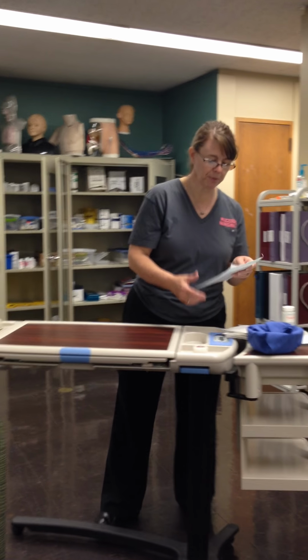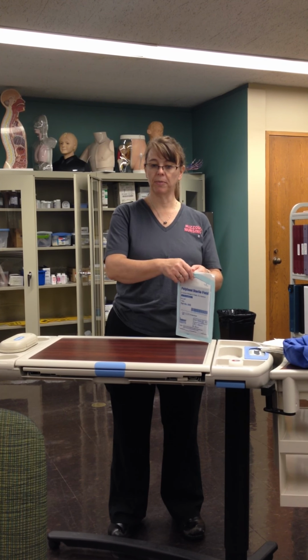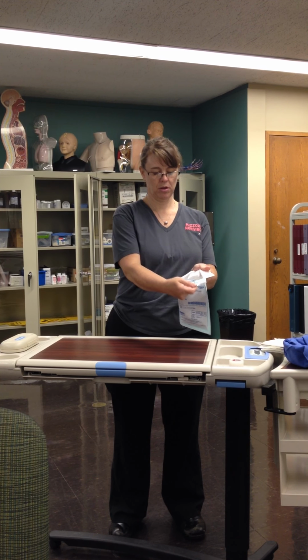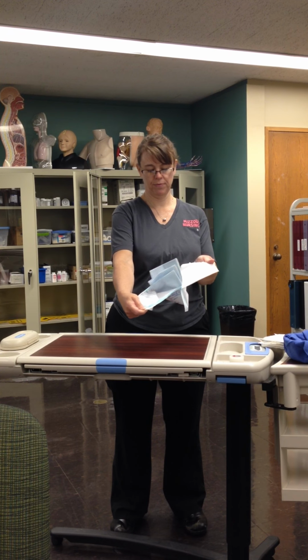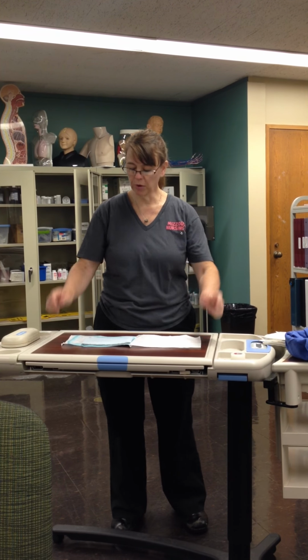So the first thing we're going to put on is our sterile field. When we open, and this is what I was talking about in there, we're going to open away from us. Lay that down. Now, where the majority of you go wrong is you try to be overly neat. You can pick your trash up later. Don't get all neat on me, because if you do, you're likely to contaminate.